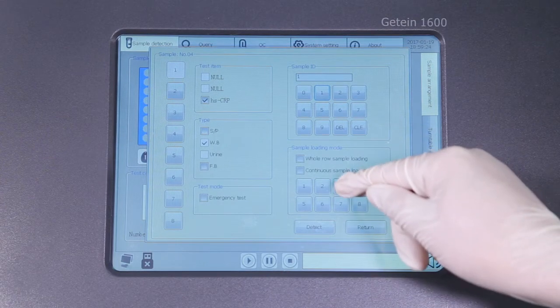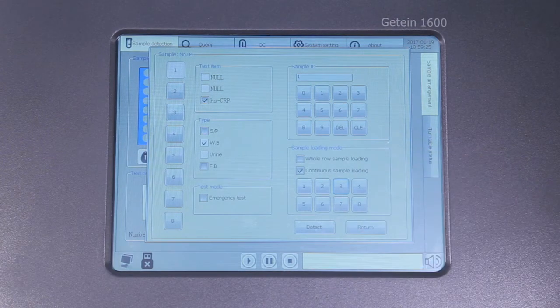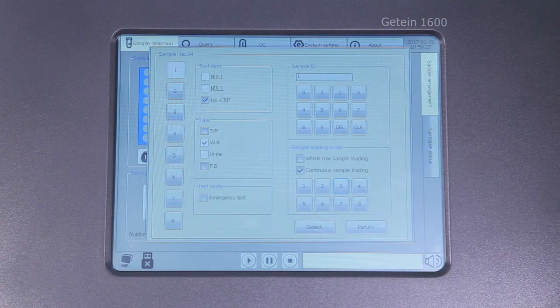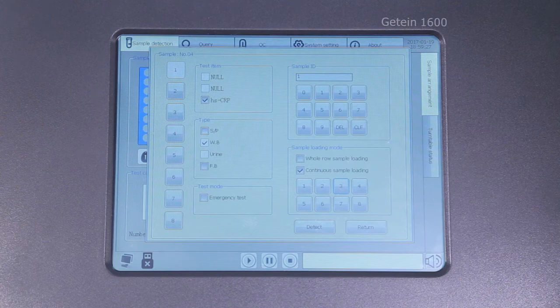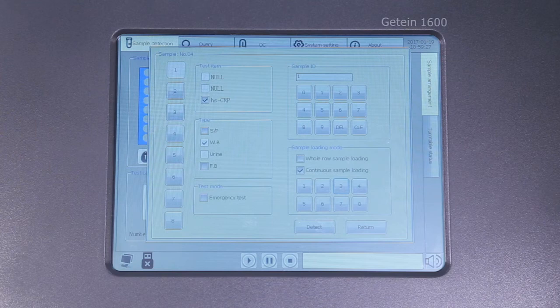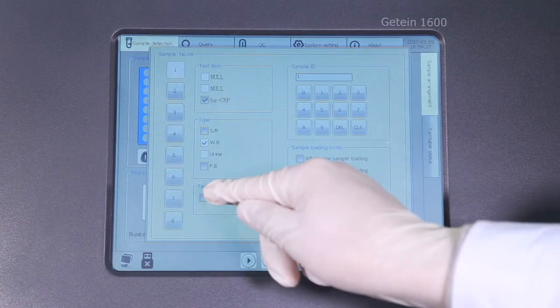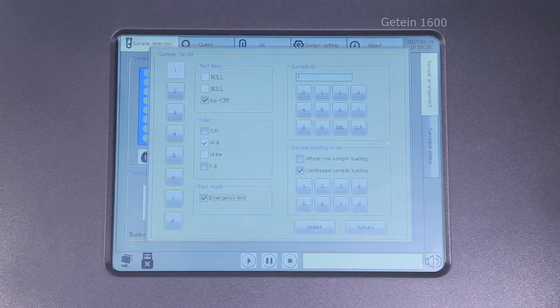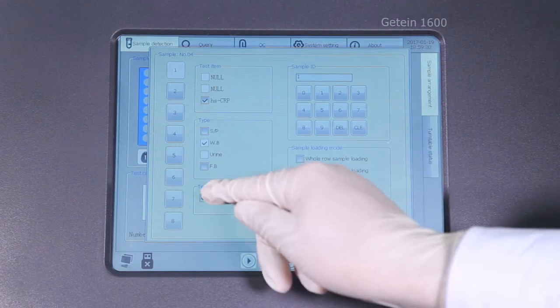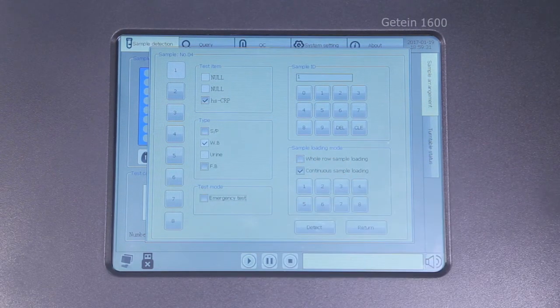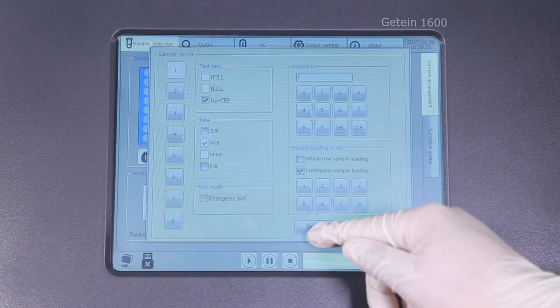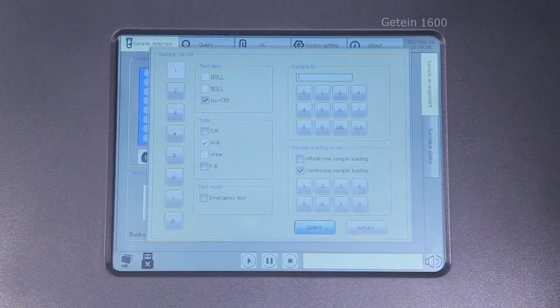Sampling mode: Whole row sample loading, 8 samples, can be used when all 8 samples in one holder are ready for testing. Continuous sample loading can be used when sample size in one holder is less than 8. Emergency mode mainly for urgent or special samples.